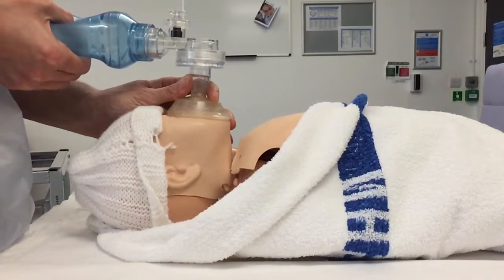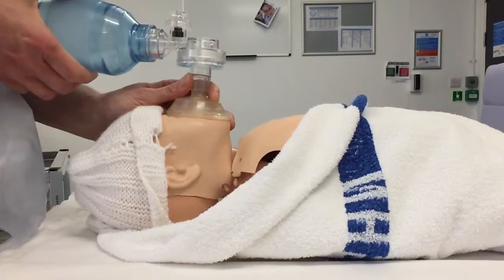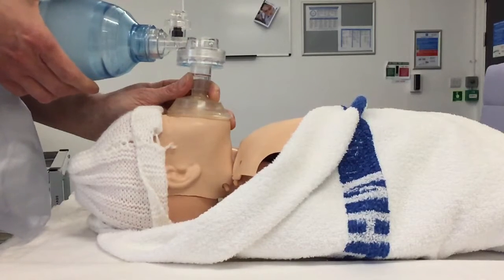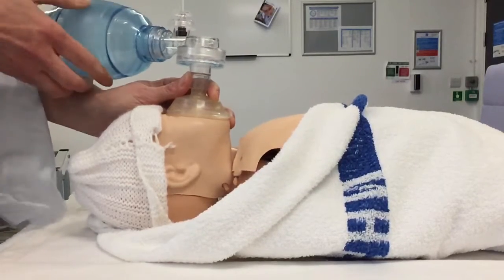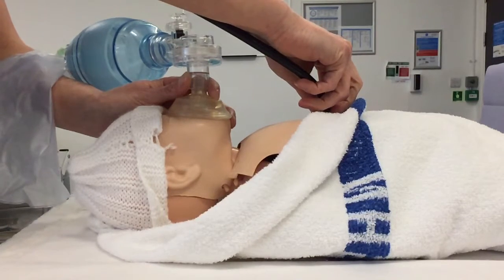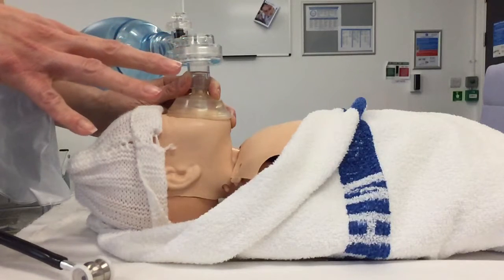Then I would redo my inflation breaths — five long, slow, sustained inflation breaths. Then I would reassess the baby. What's the baby's heart rate? The heart rate on this baby is slow — it's still slow. And is the baby breathing at all? No, it's not.